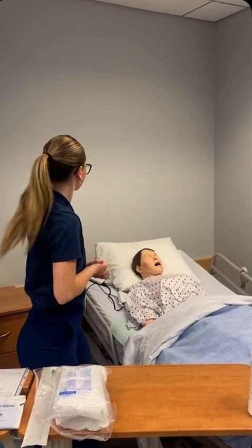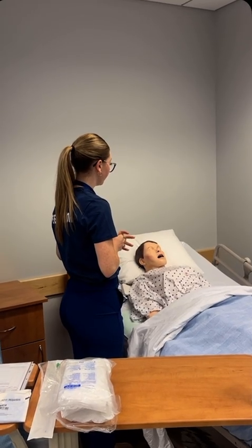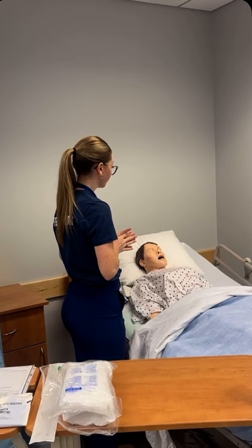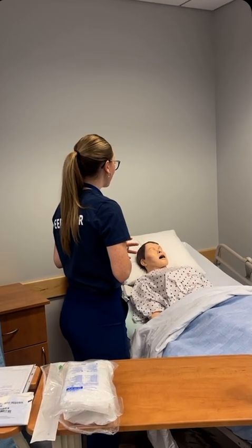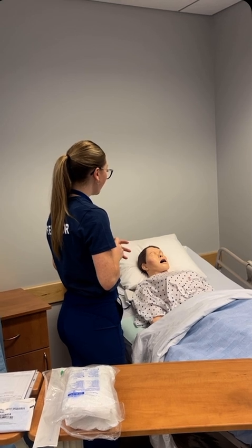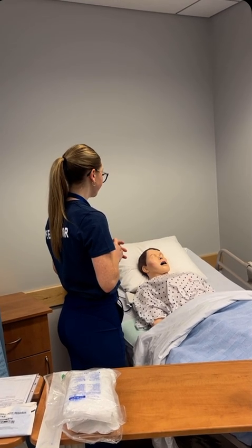Introduces self formally using full name and identifies self as a nursing student from the University of Windsor and states their pronouns as well as their role. Hi, my name is Gabriella DeJesu. I'm a fourth-year nursing student at the University of Windsor. I identify as she, her, and today I'm going to be inserting a catheter.